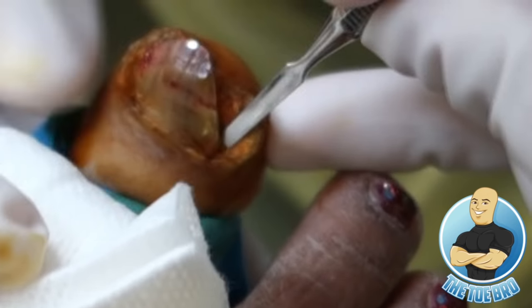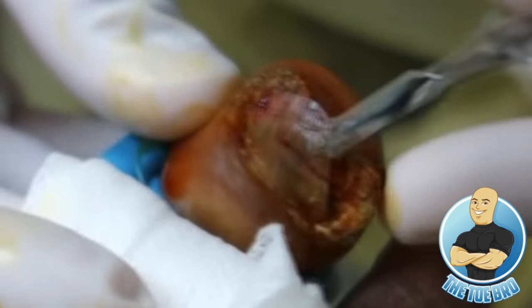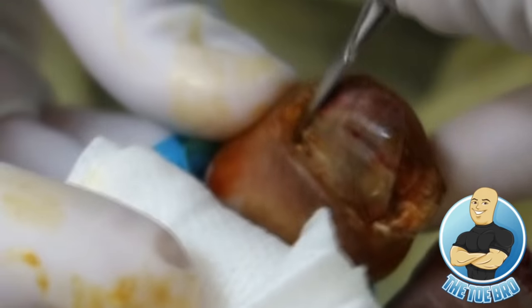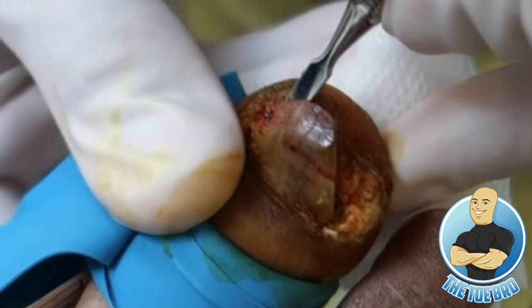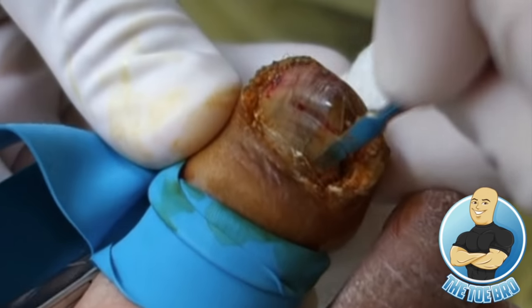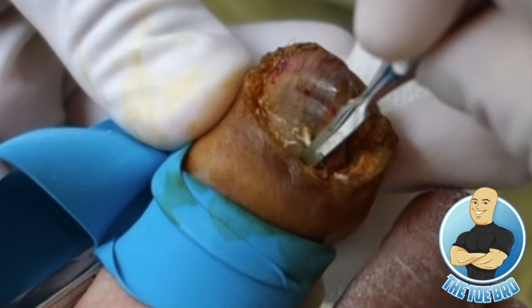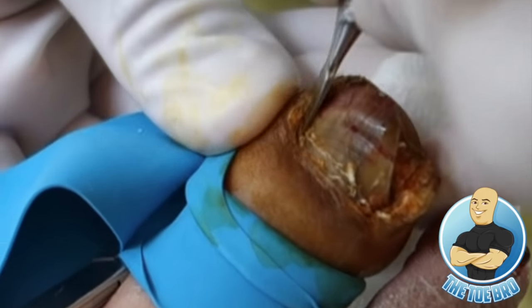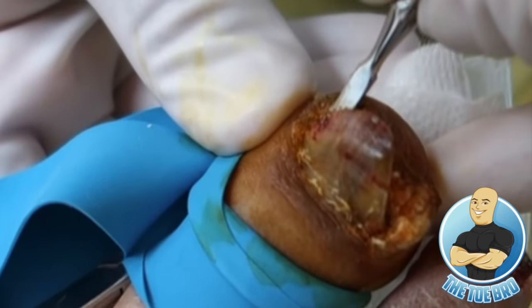Okay, we're doing a little test. Do you feel anything sharp here? No. Anything sharp here? No. Anything sharp here? No. Okay. So after making sure that I know the patient's completely numb, the first step is to separate the nail from the cuticle and the nail bed underneath using a special tool called a nail elevator or nail separator.